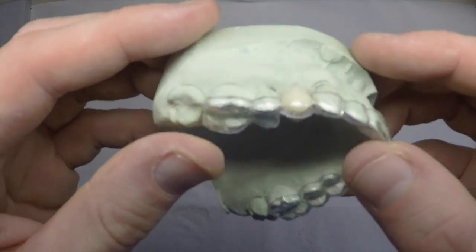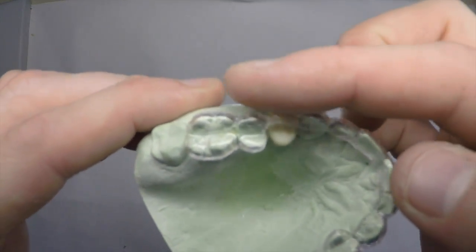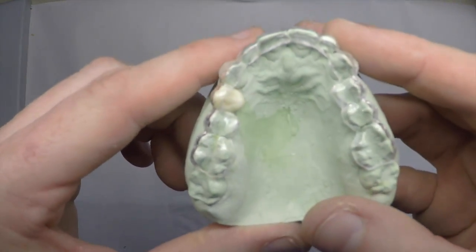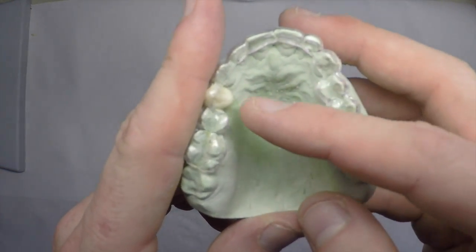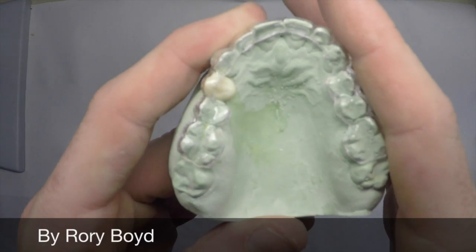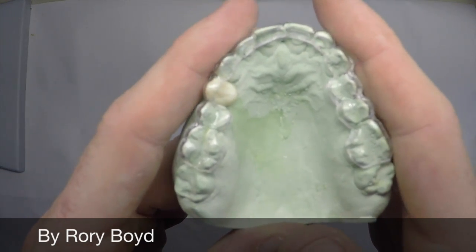We mark the gingival margin and also the buckle wall. Therefore, when we're using our directional indicators, we have a reference point of where the buckle of the tooth is to ensure that the screw access channel will be in the correct position.